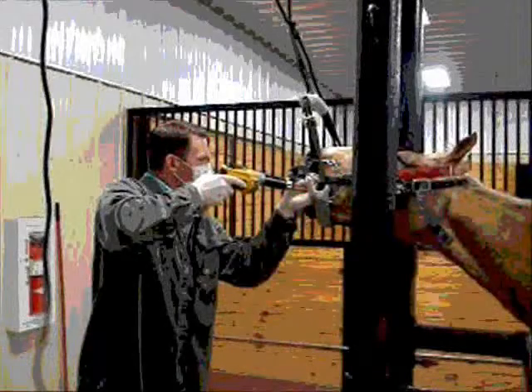There are four dental arcades — two on the top, two on the bottom — each consisting of six teeth. We will evaluate each arcade for even wearing, loose teeth, spaces between the teeth that may be packing feed, and teeth that are abnormally tall or have hooks, which do not allow the mouth to move freely.